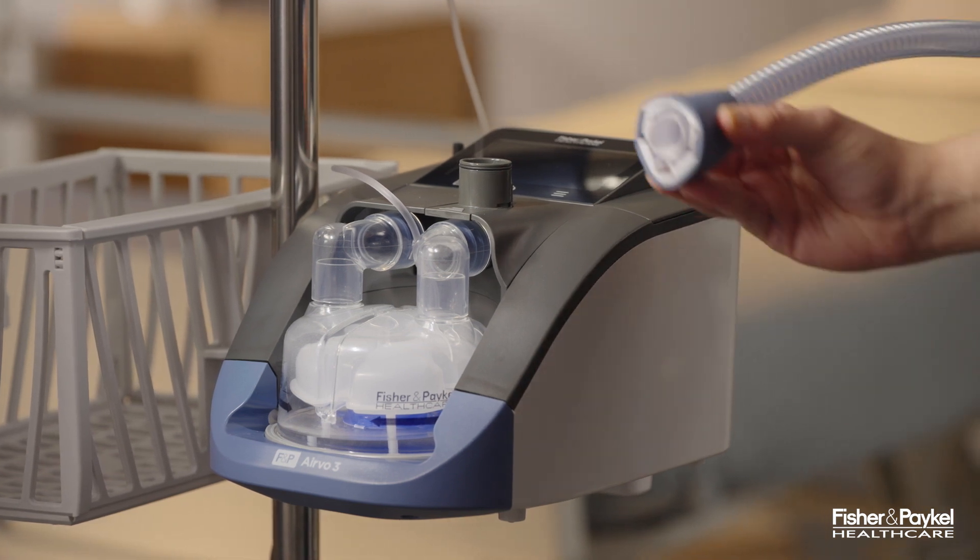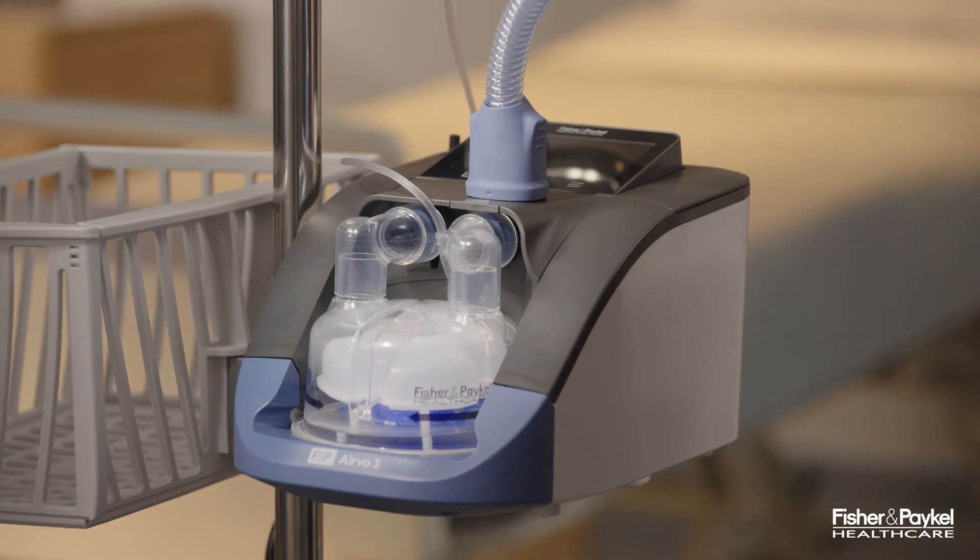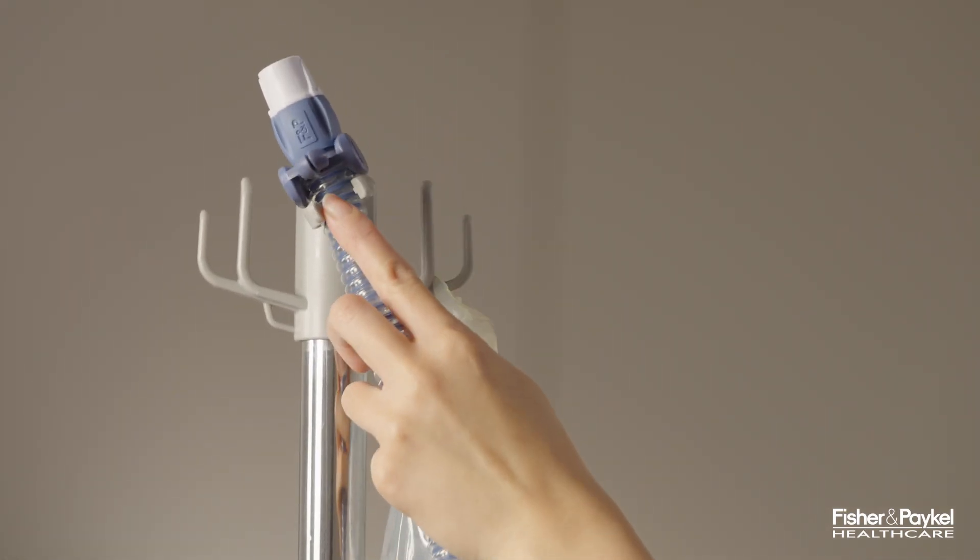Connect the breathing tube by lining up the pins on the top of the Aervo 3. Push down until you hear a click, locking the tube into place. Secure the breathing tube to the pole.